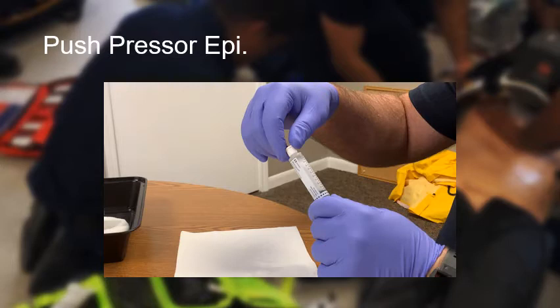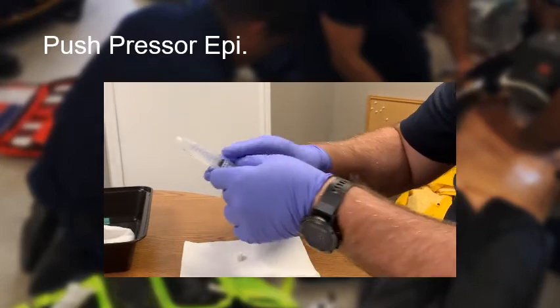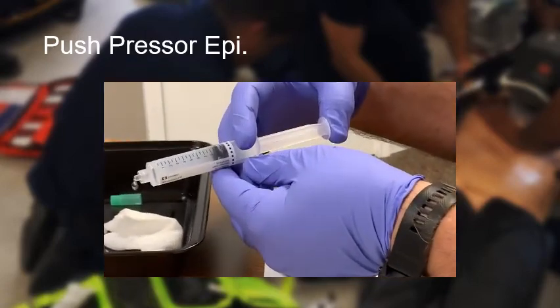Using your newly created dilution of epinephrine 1 milligram per 10 mLs, you may now create Push Pressor Epi. Please do not create the Push Pressor Epi until needed during patient care. Taking a second syringe of normal saline, expel 1 ml.